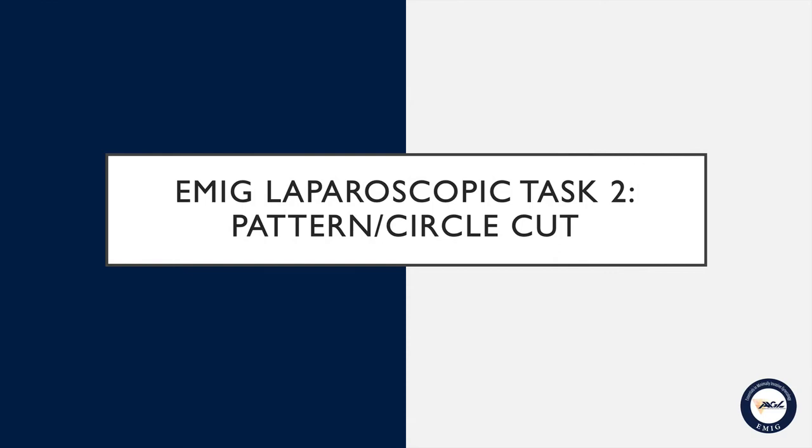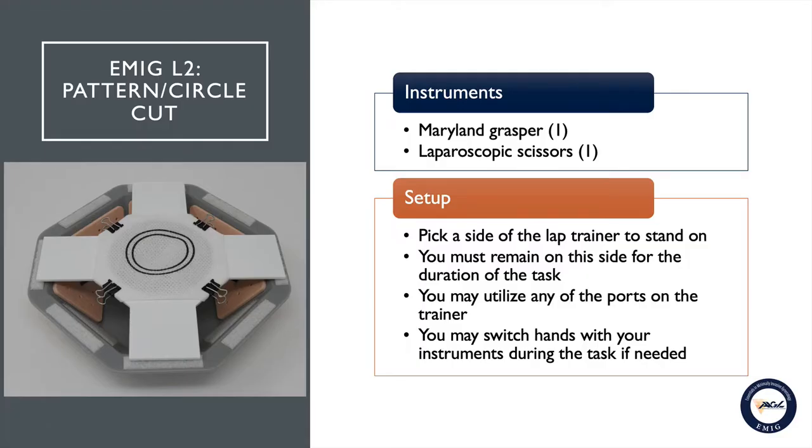EMIG task number two, pattern or circle cut. You will be provided with a Maryland grasper and one laparoscopic scissor to perform this task. You must pick a side of the lap trainer to stand on.